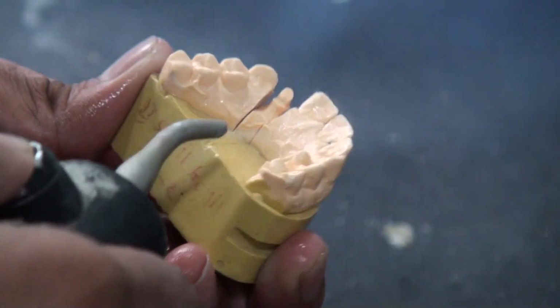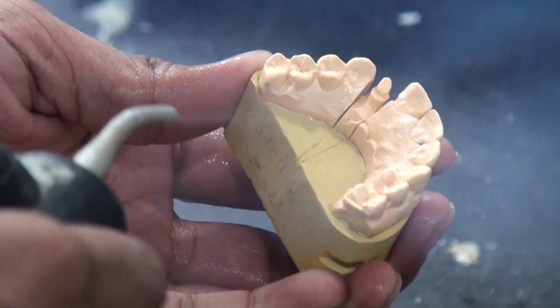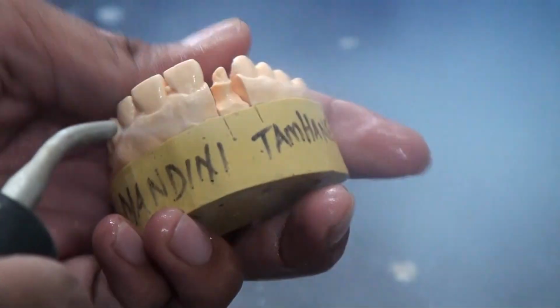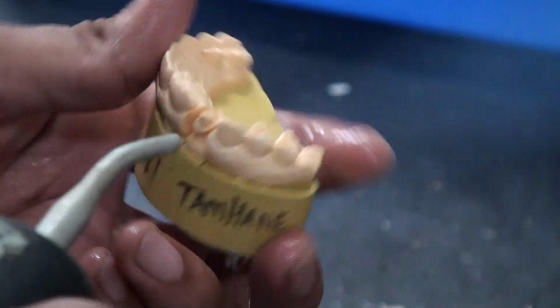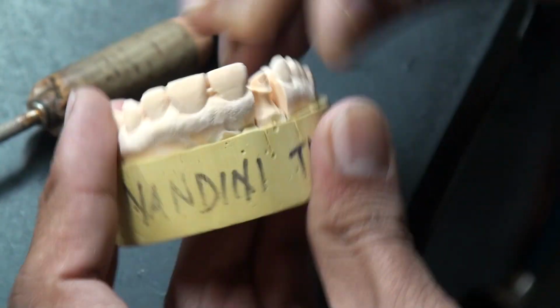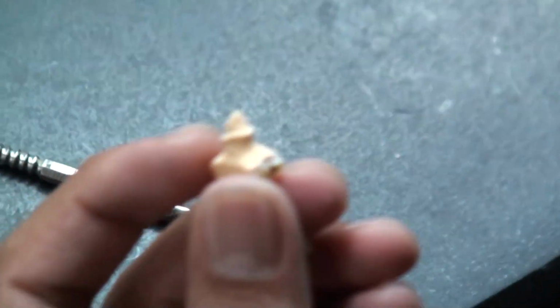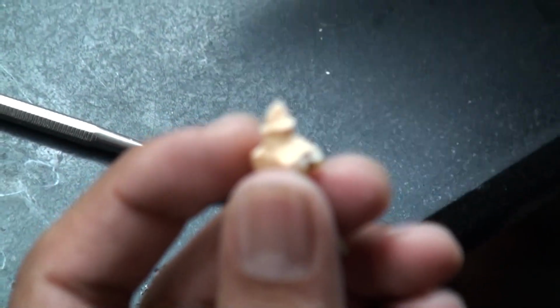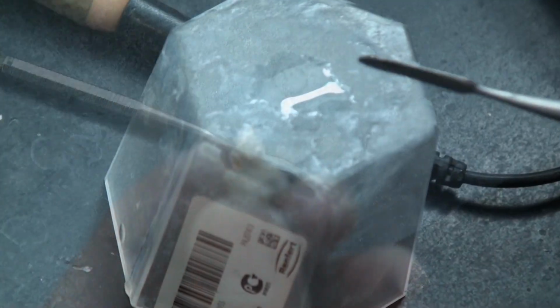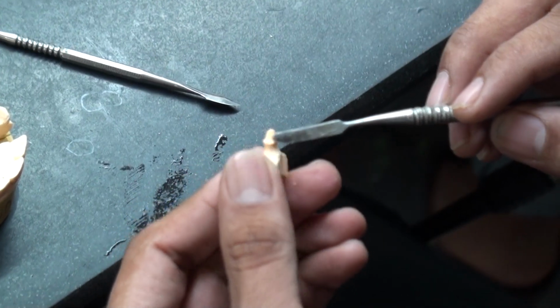This is a different model, but it's the same thing. Now this is a finished model, all the dies are cut, it's been ditched. To get the model clean, he's using a steam cleaner, free of any debris, and you can see this is ready. Now sometimes you just want to give it a little push on the underside to get the dies out, and that's our prepared die. And the first step is to get a little hardener onto the die.